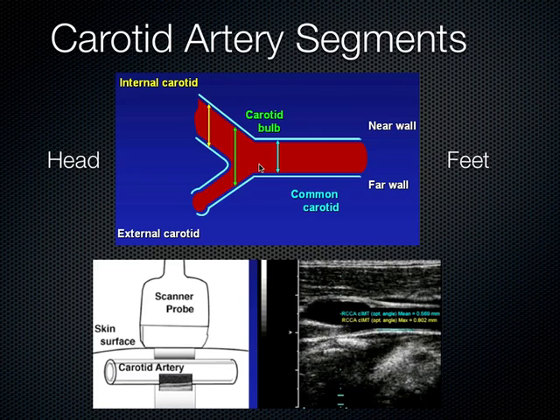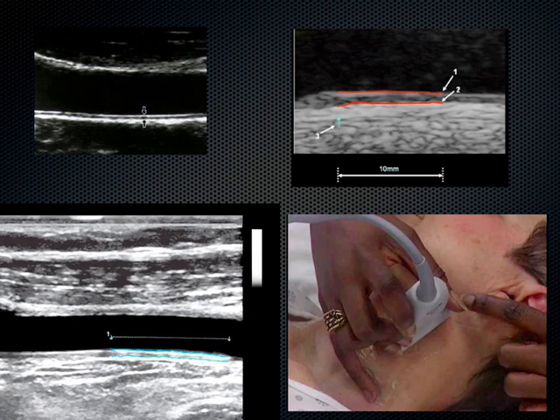And because of this tubular shape the vessel has here, getting a good perpendicular location relative to the ultrasound transducer's beam basically gives you very, very nice images of the carotid artery. You can turn that frequency up and get beautiful images at this location. And it looks like this when we're measuring it. We try to trace it along for about a 1 centimeter length along that posterior wall.